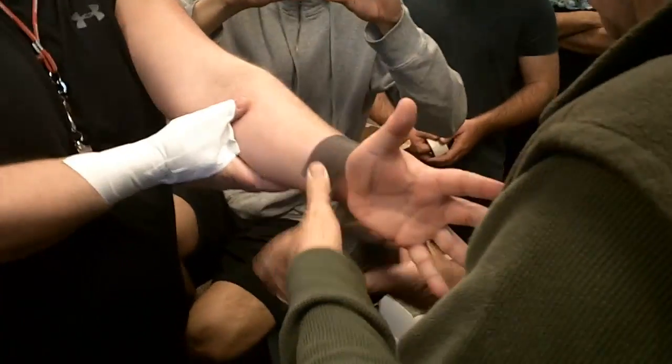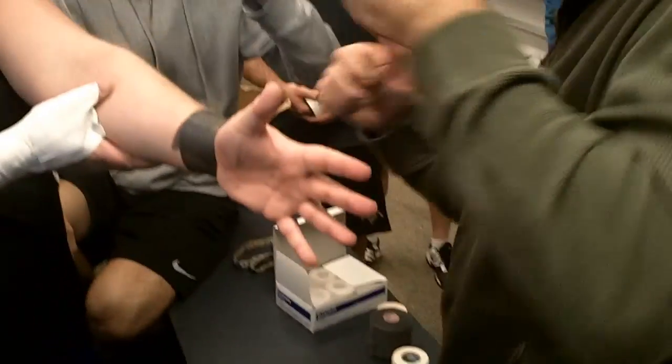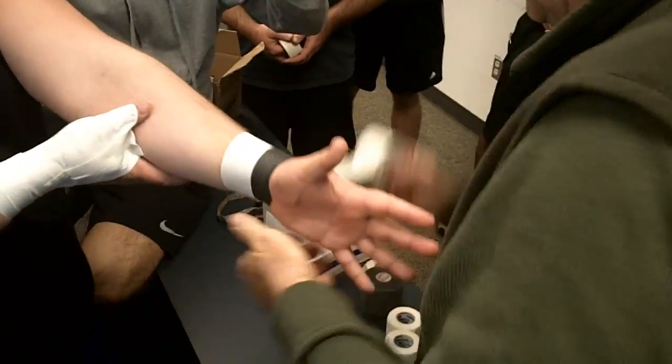So let's do the other thumb. So the pinching — it's like instead of trying to pipe the tape... why fight it? Make it work. Open wide. Put our anchor on.